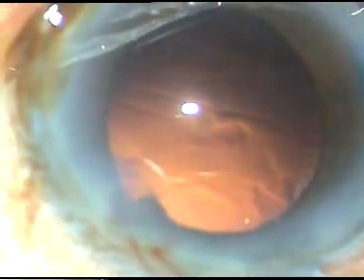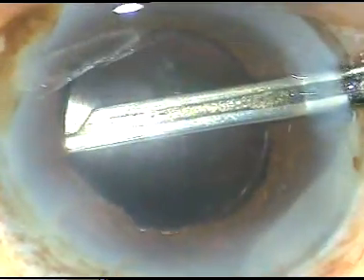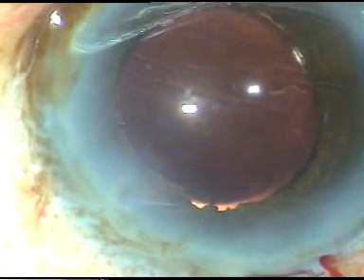And then the chopper — whenever iris prolapses through the side port, I don't remove the chopper. In this case we have implanted a hydrophilic acrylic intraocular lens.